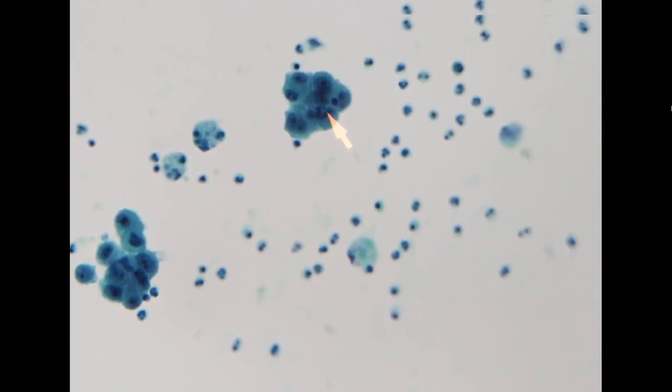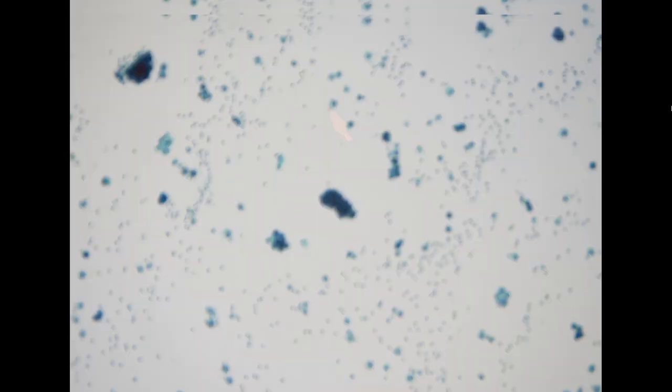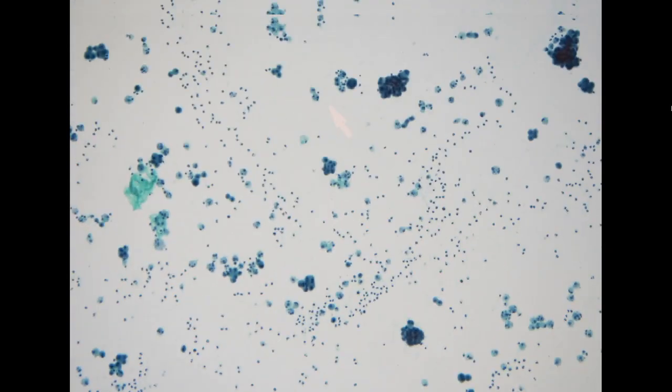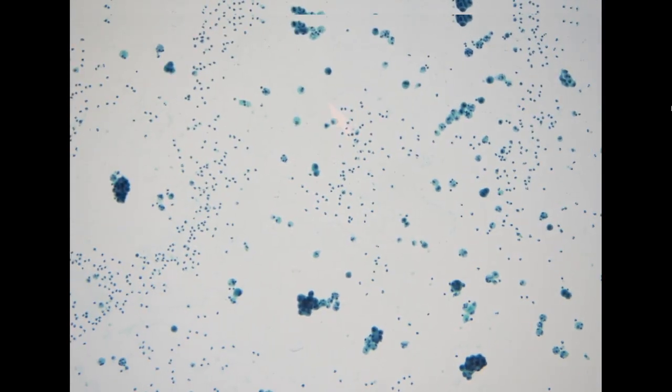And when you do the CPR, I think everybody knows how to do it. You press very hard on the chest, and so it will actually cause some shedding of the mesothelial cells into your pleural effusion. So this is actually caused by the treatment. This is iatrogenic. So these are not metastatic adenocarcinoma. These are all reactive.